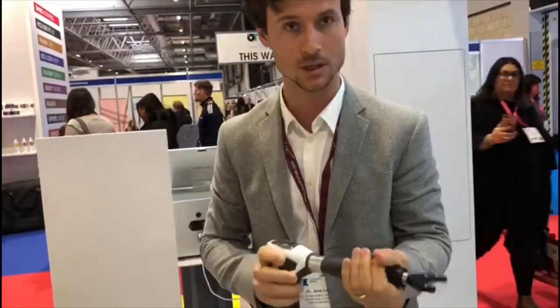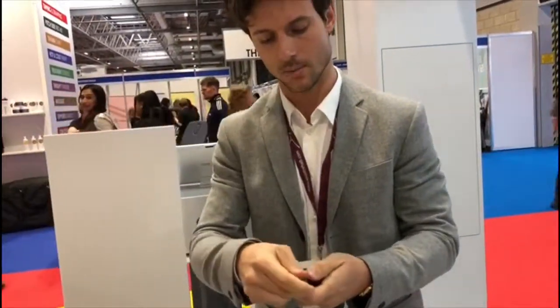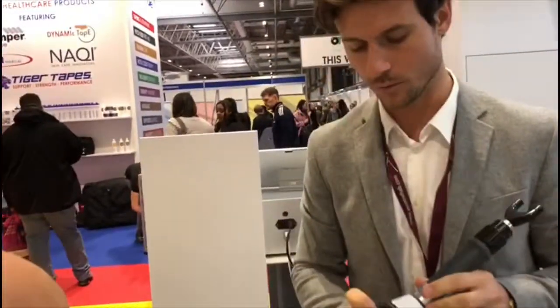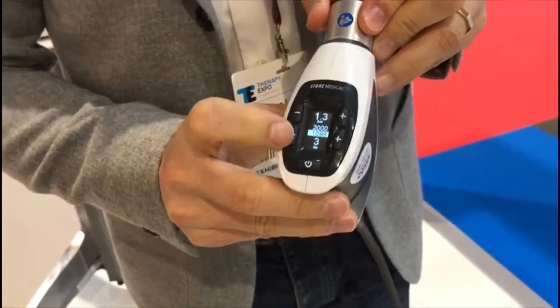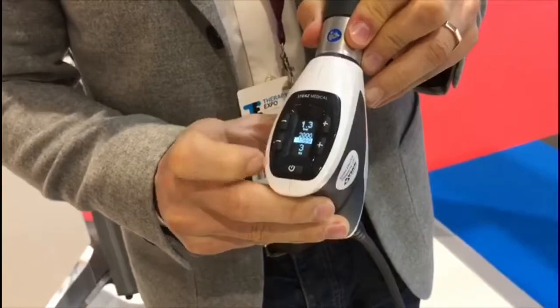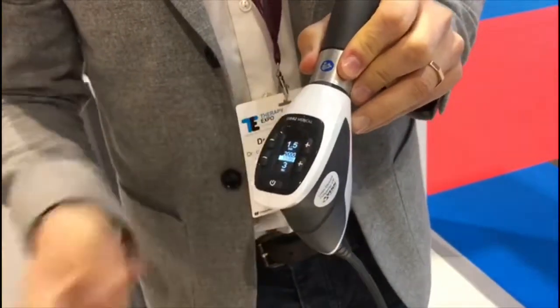When trying to mobilise the joint, I will use a low frequency because I don't want a reflex response from the body. So I will use a low frequency of maximum 3 Hz. I might go down to 1 or 2 as well, but 3 I would say. Bar-wise, you can start at 1.5 — that's okay.